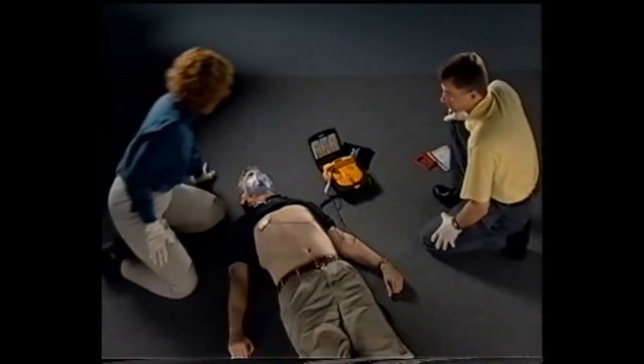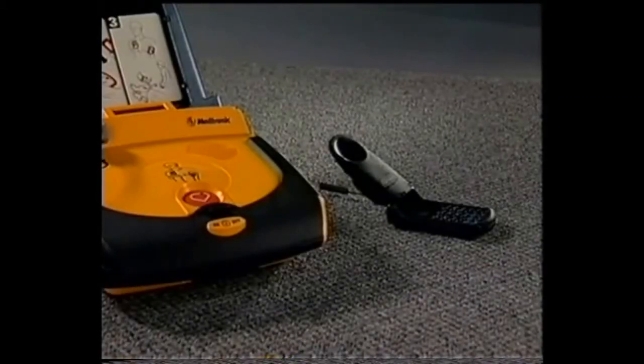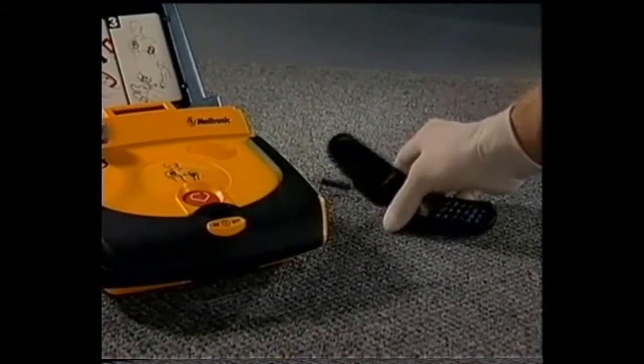Stop CPR. If the motion prompt continues, check for other possible causes of motion, such as the patient is breathing, or handheld communication devices or other equipment that may emit interfering radio frequency signals. Move these at least 4 feet away from the defibrillator and patient.